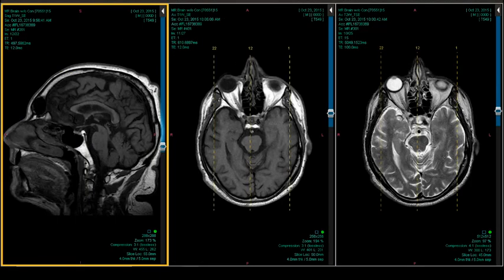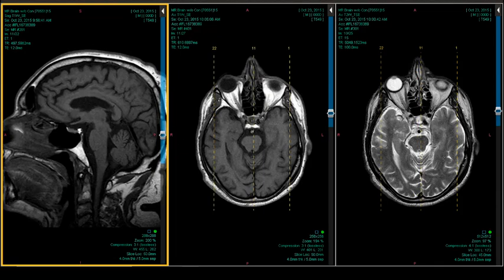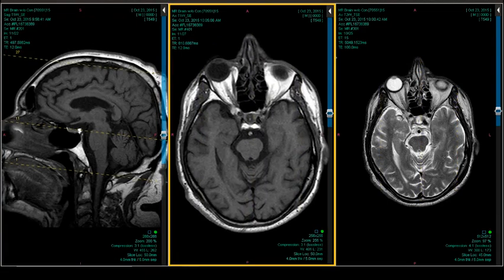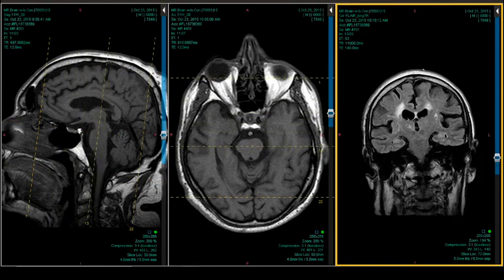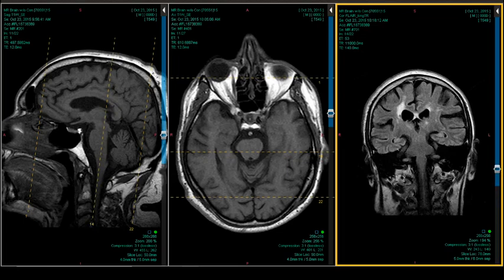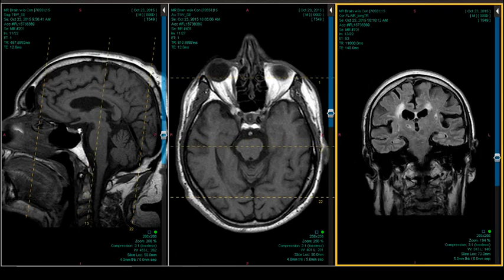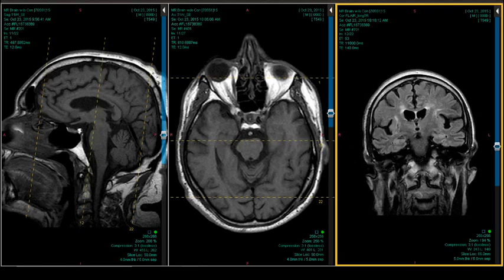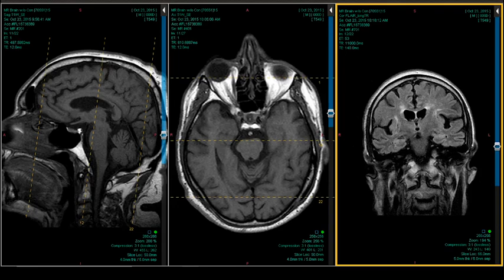I'm going to throw up the sagittal just so they can have a look at the brainstem, and they have their own. And maybe a coronal, Dr. Schupek, to look at the entorhinal cortex? Right, maybe. Now, entorhinal cortex, Dr. Pomerantz mentioned that a couple times. What's the entorhinal cortex? Well, basically, you find the collateral sulcus right here, and everything medial to that. When people talk about the entorhinal cortex, that's what they're talking about. So the hippocampal formation, the anterior portion of it. Yeah, here's the collateral sulcus for you young'uns, and then here is the entorhinal cortex.